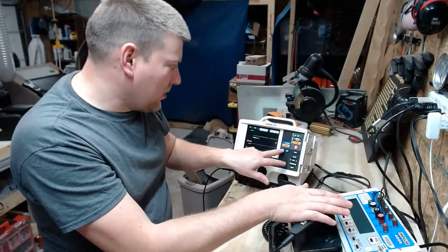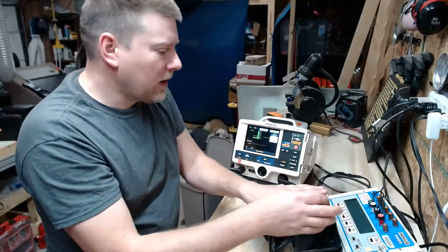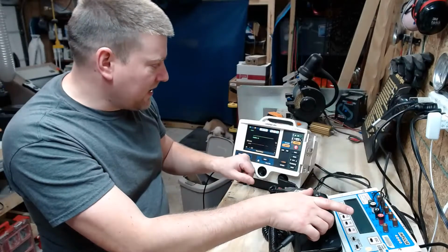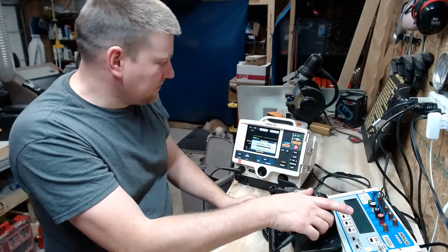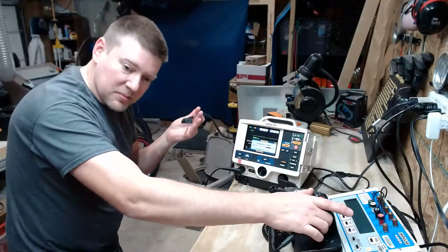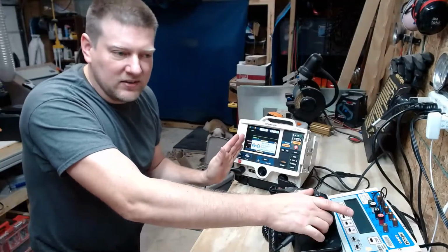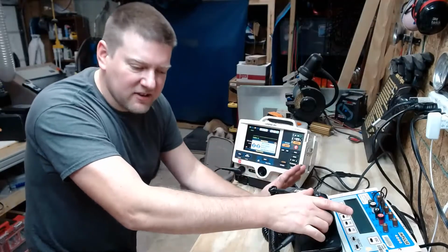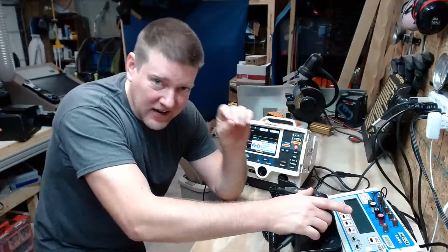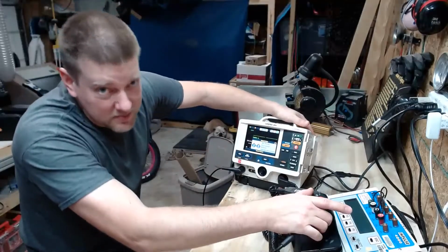Let's see. I'm going to set this guy to paddles. Okay. You can see I've got a good connection here. It's a flat line. We're ready to go. I'm charging it at 360 joules. Remember, guys, we're doing this completely on battery power. You want to know the amount of time it takes to charge to the maximum energy. And if I remember right, it's less than 9 seconds. So if it takes you longer than 9 seconds, it means your internal batteries are going bad.